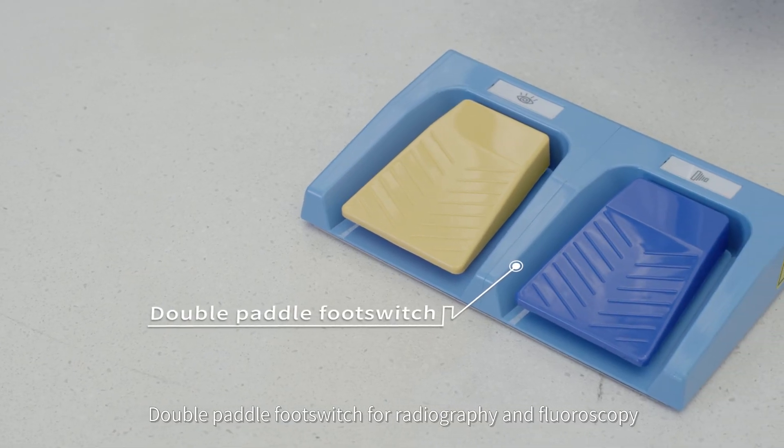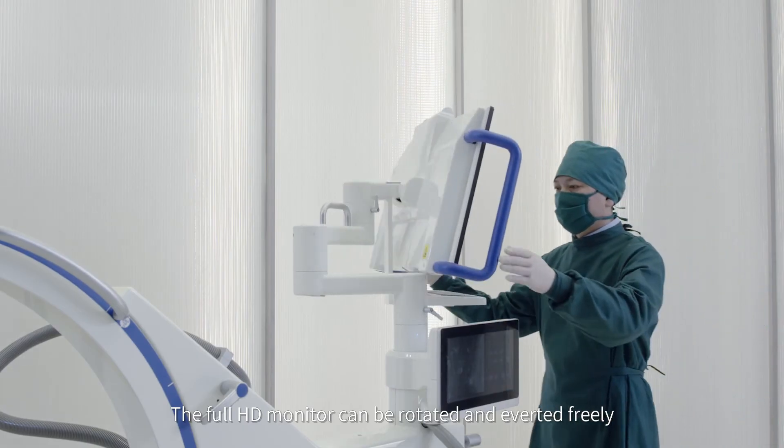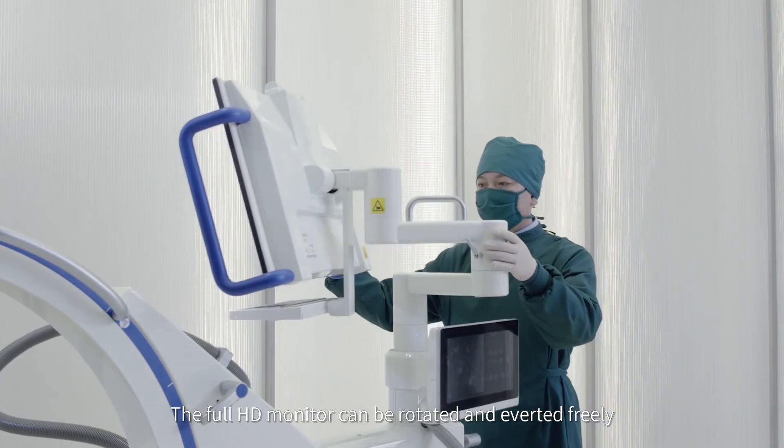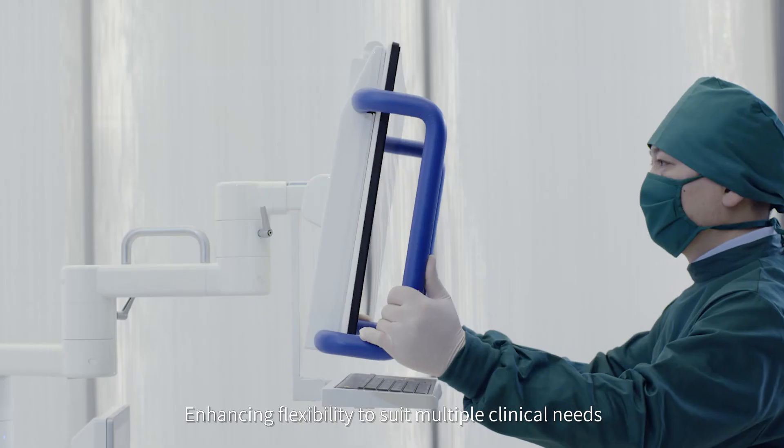A double paddle foot switch supports radiography and fluoroscopy. The full high-definition monitor can be rotated and diverted freely, enhancing flexibility to suit multiple clinical needs.